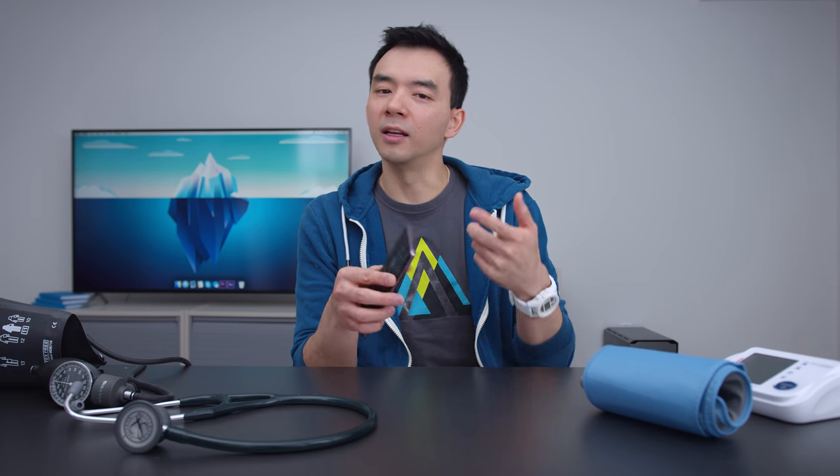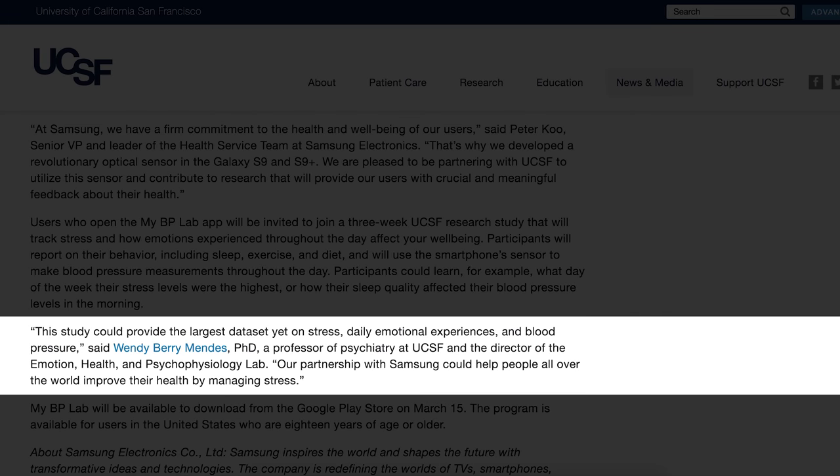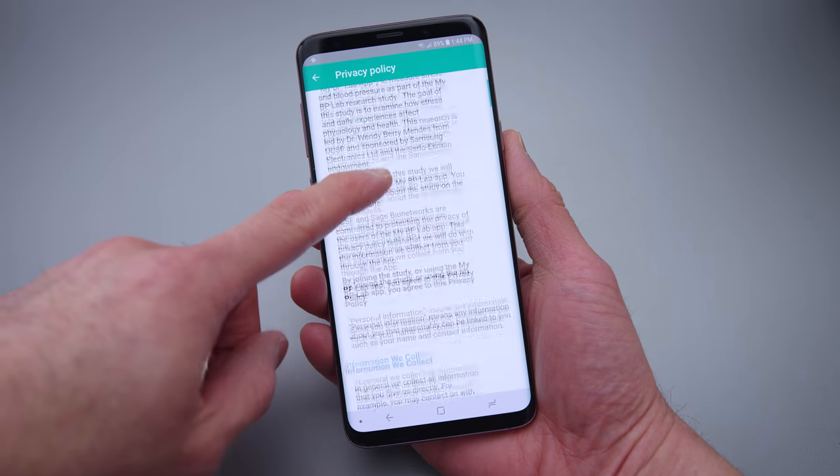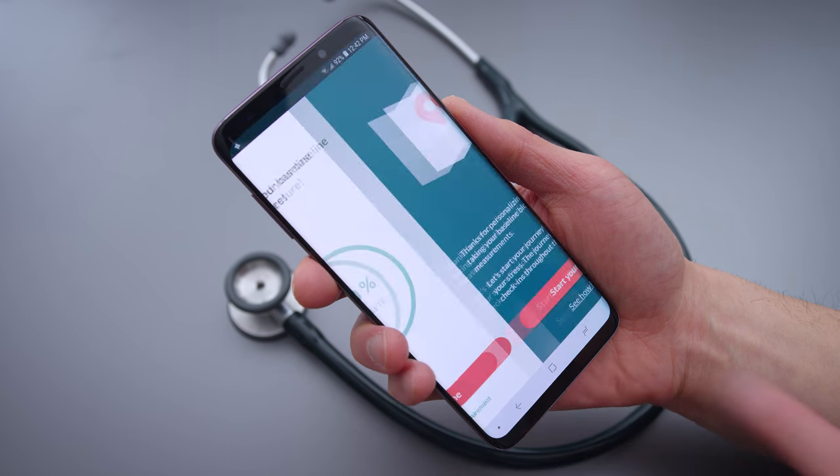Now this may change in the future, but as of today — the middle of March — it's the only way to use this blood pressure sensor on the S9 and the S9 Plus. When you set this up, the first thing you'll notice is that this is a research study. The data the app measures and collects is used to explore the relationship between stress and health. It's an interesting study, but I'm here just for the blood pressure measurement. You have to sign consent forms, but it's pretty easy to get up and running.